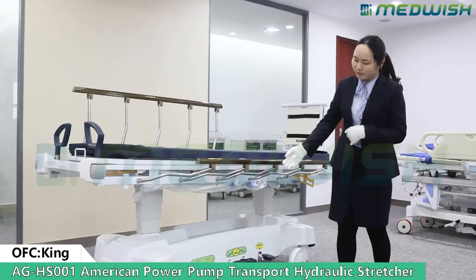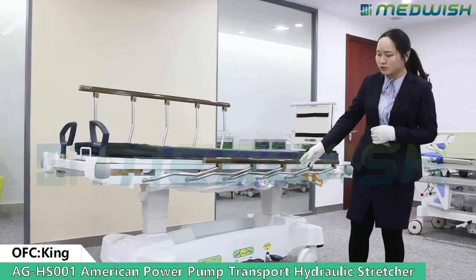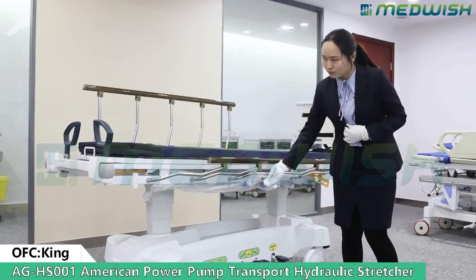Under this stretcher we have a dust cover made by ABS material. Also you can put the oxygen cylinder into here.